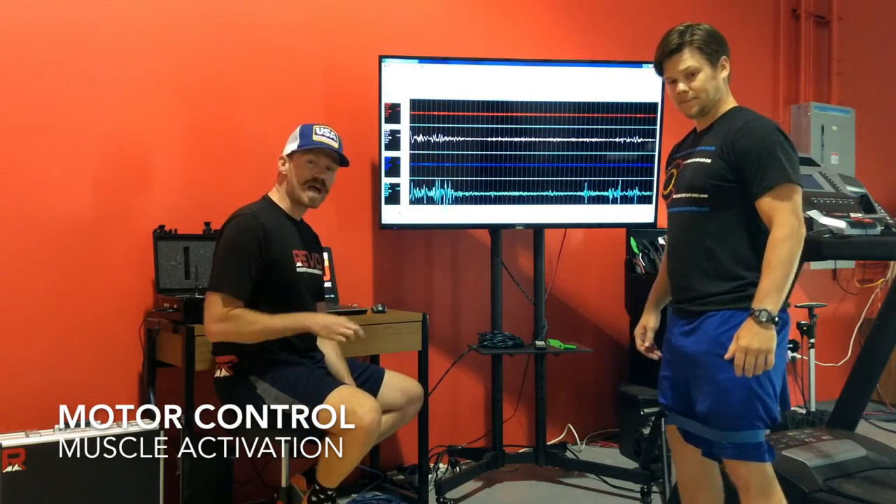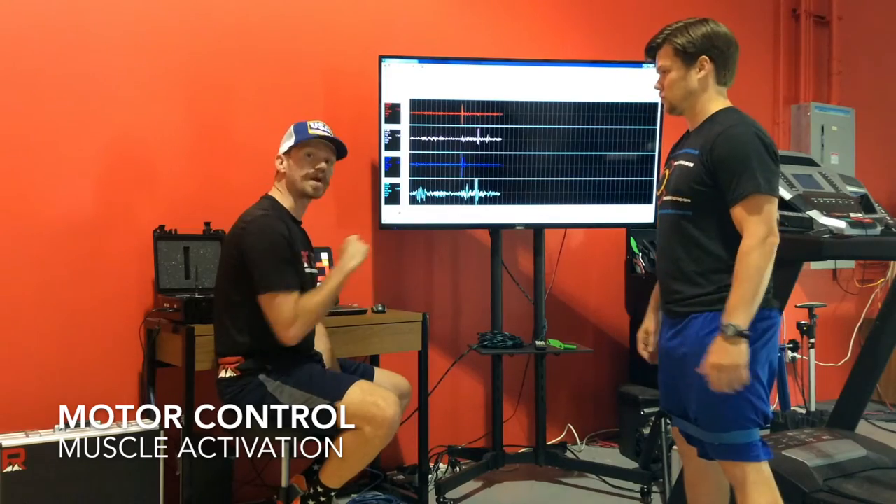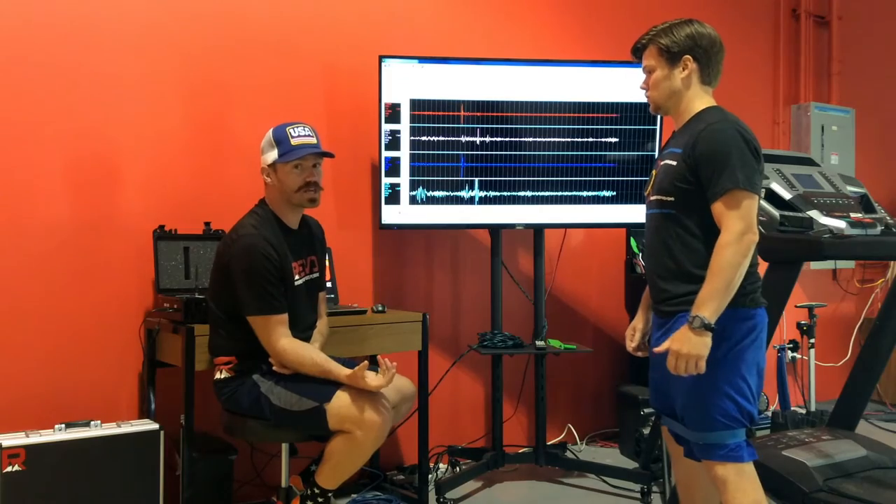Brian has four EMG sensors on — one on either glute and one on either hamstring. Let's look at a couple of the movements and activation patterns that we assess.